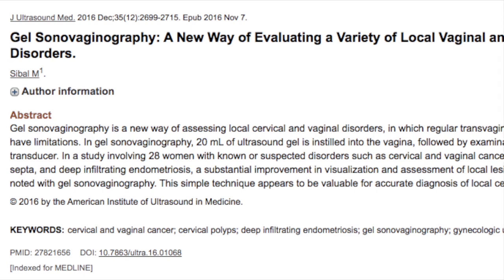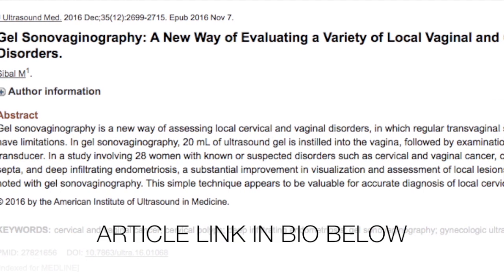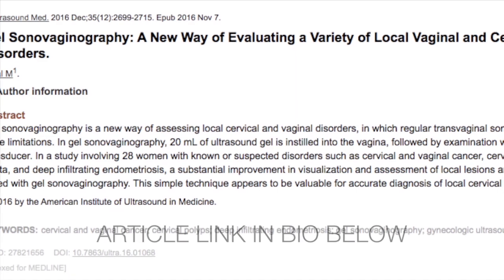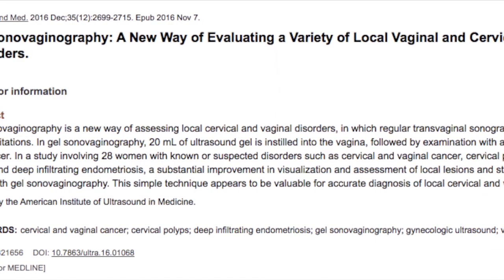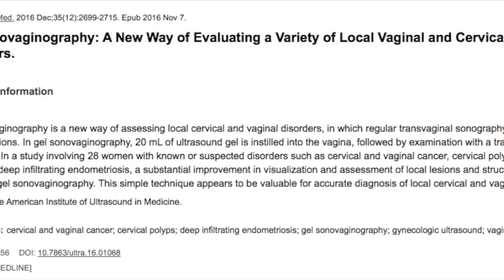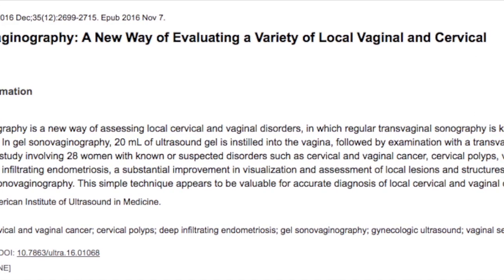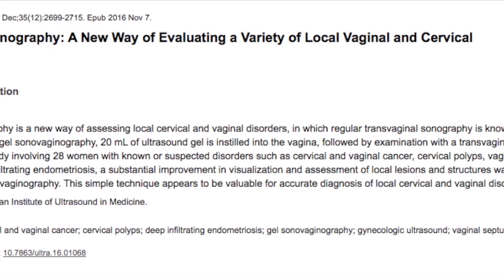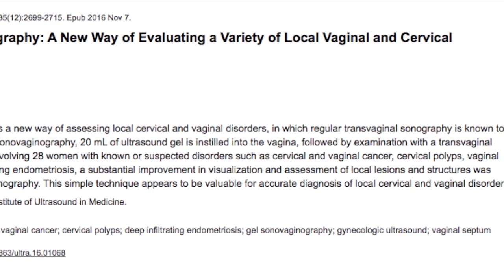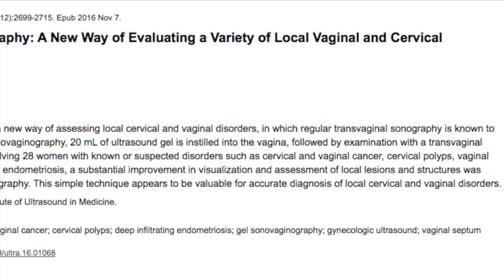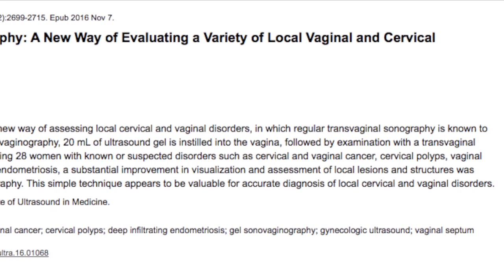The next step is gel sonovaginography. This is a wonderful technique outlined by Dr. Mala Sibal, in which she packs the vagina with copious amounts of gel — at least 10 to 20 cc — allowing much better visualization of the posterior fornix as well as the cervix that would otherwise escape optimal visualization on a regular ultrasound.